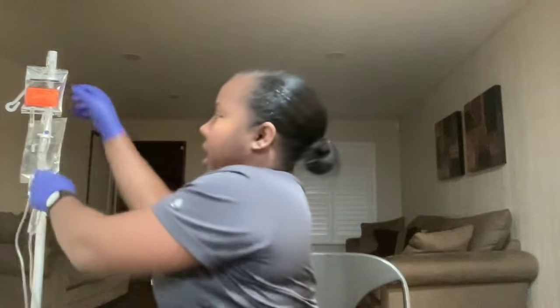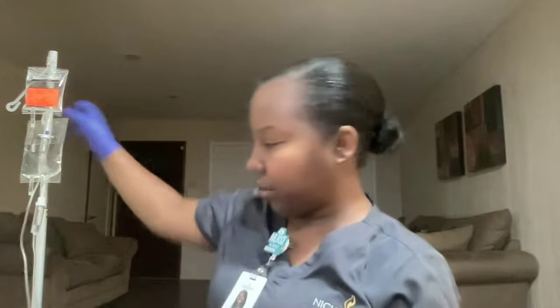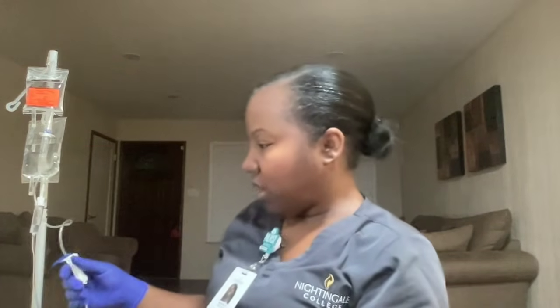And again, I am making sure that this is 30 inches above my patient, and it's also above the IV fluid. So we want to flush the line to get any air bubbles out.